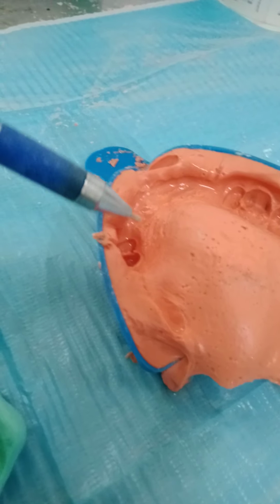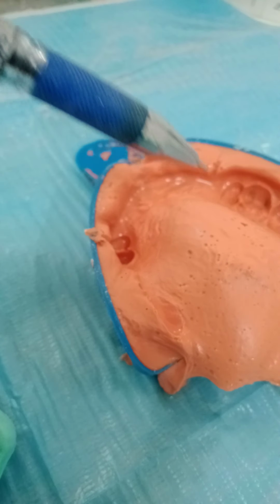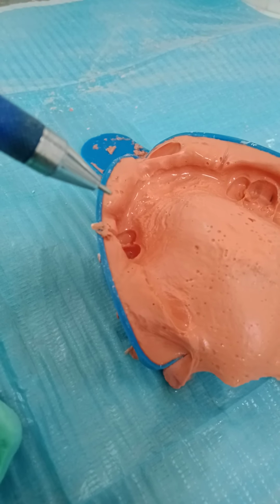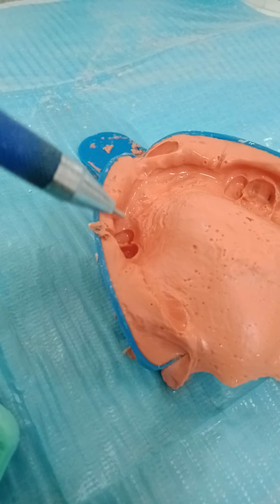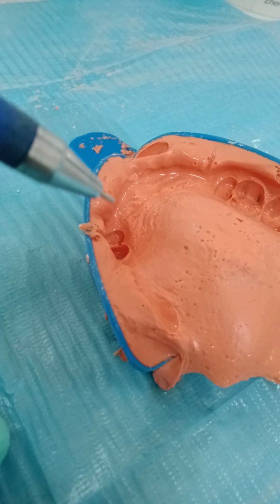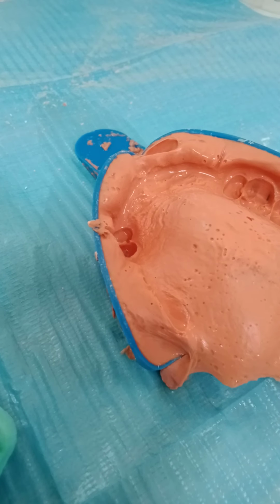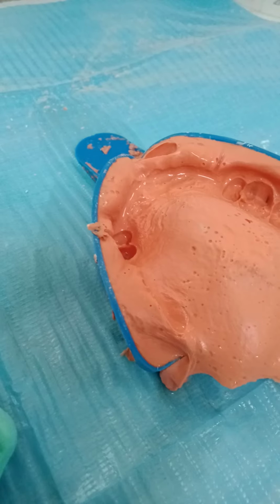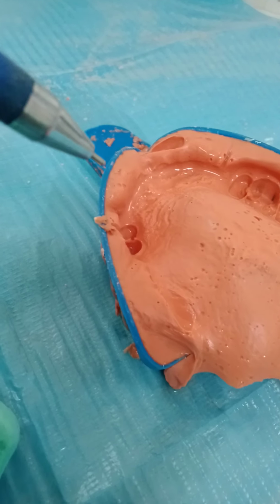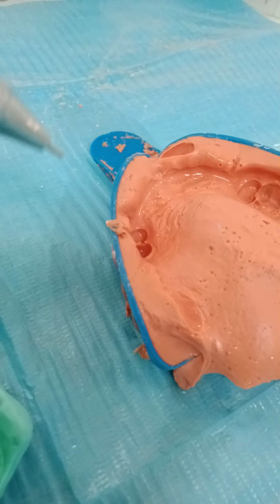So it's considered a class 2, but I'll work as if it's a class 4, because I have a long edentulous span anteriorly. This patient also has a class 3 bone relationship, so I'm going to extend my teeth and acrylic anteriorly a bit more for camouflage, to compensate. I'm going to add a lot of material here to replace this tissue. I'll treat it as a class 4.